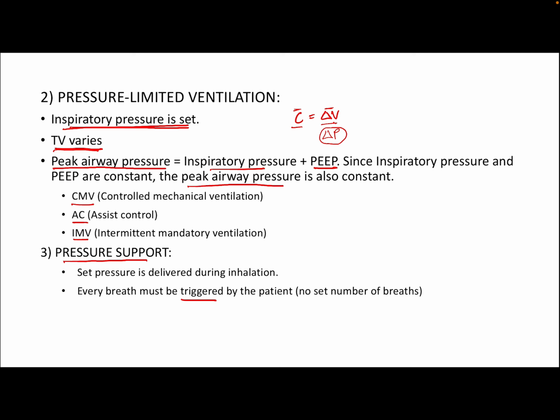This is because the ventilator provides the most support to breathing in this mode, and it also allows the patient to trigger breaths above the set limit. So this is essentially reducing the risk of atrophy of respiratory muscles. And patients with respiratory failure require more ventilator support than those patients whom mechanical ventilation is done just to protect the airway.